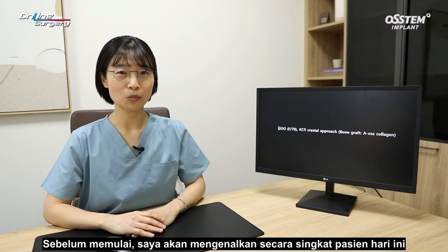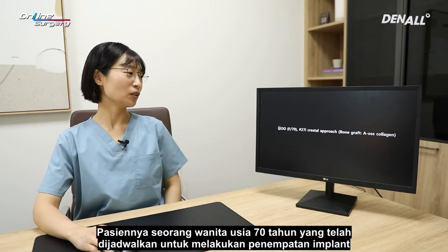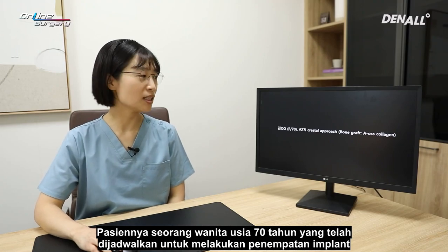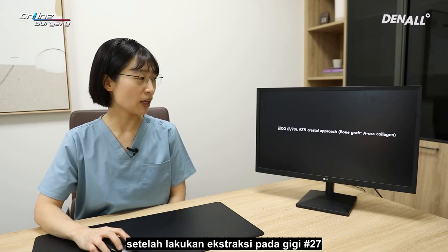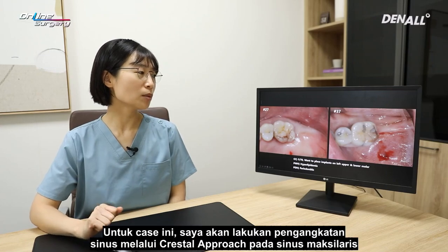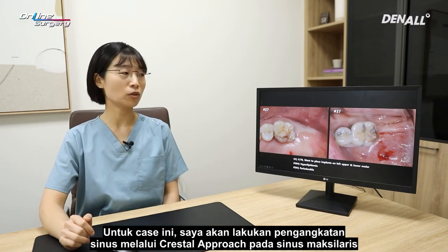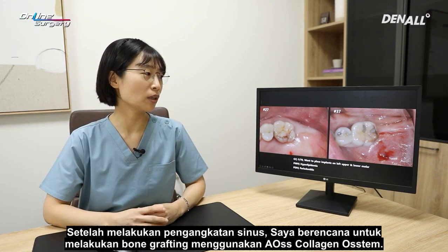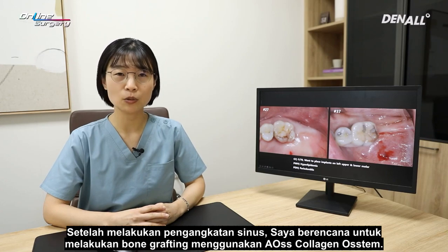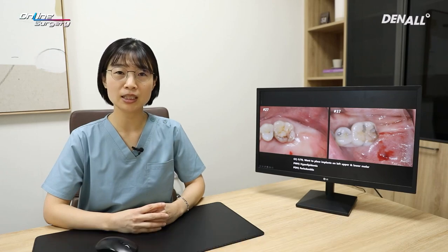Before we begin, let me briefly introduce our patient of the day. The patient is a 70-year-old female who is scheduled for implant placement following the extraction of tooth number 27. For this case, I'll perform a sinus lift using the crestal approach on the maxillary sinus. After sinus lift, I plan to proceed with bone grafting using AOss's AOss collagen.